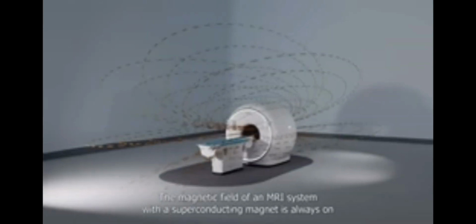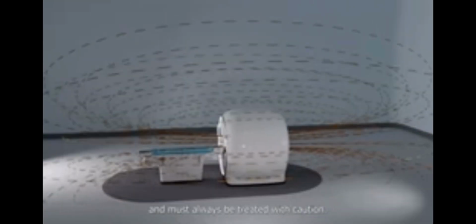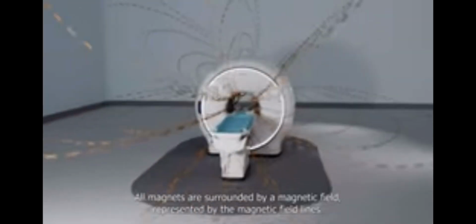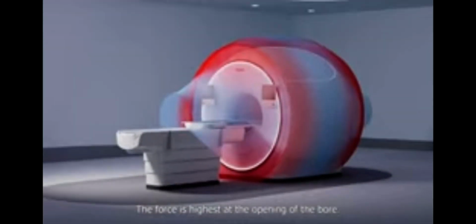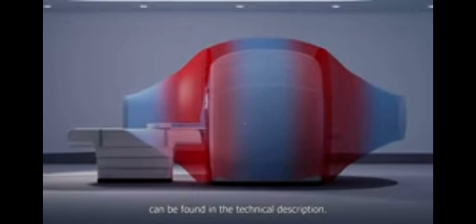The magnetic field of an MRI system with a superconducting magnet is always on and must always be treated with caution. The main magnetic field is not completely contained within the bore of the magnet. All magnets are surrounded by a magnetic field, represented by the magnetic field lines. The magnetic attraction force varies around the scanner. The force is highest at the opening of the bore. More information regarding the field lines and attraction forces for different field strengths can be found in the technical description.